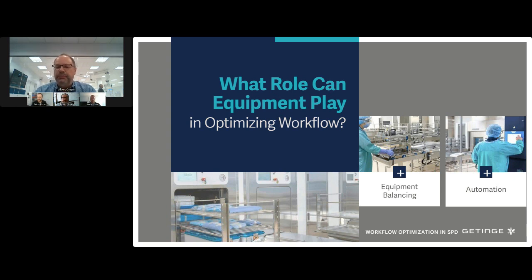So building in some redundancies with all of your reprocessing equipment is really vital to ensure patients aren't adversely affected by repairs or mishaps.